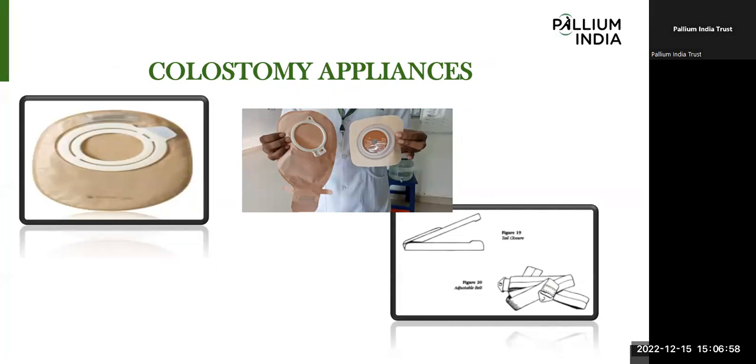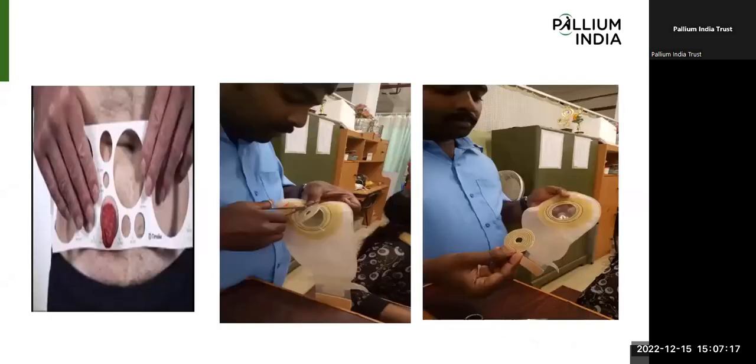One-piece method means the bag, the faceplate or that sticky part will be connected, and it's a single piece. In two-piece, the faceplate is separate and the connecting bag is separate. So we mainly use two types of colostomy bags. It's an actual picture of the colostomy bag. This picture shows the one-piece method of colostomy bag.